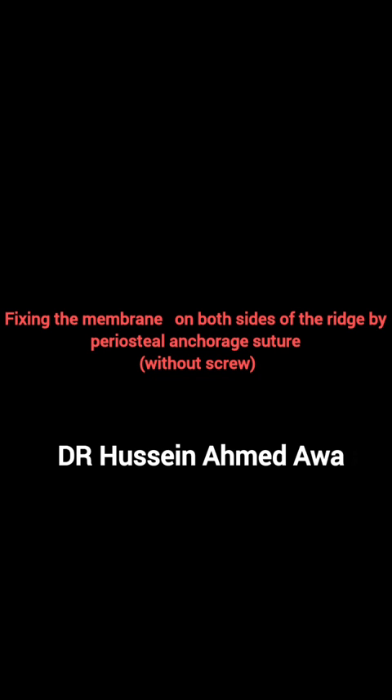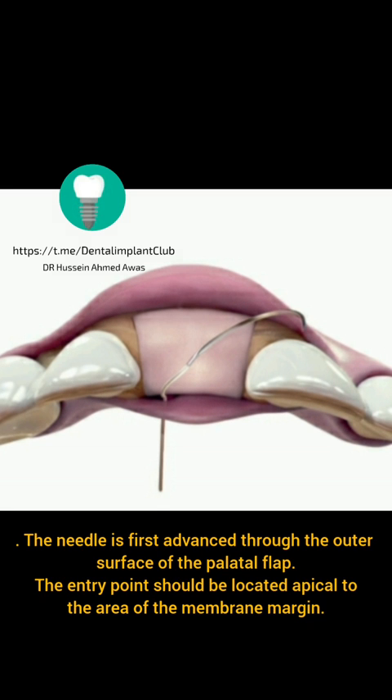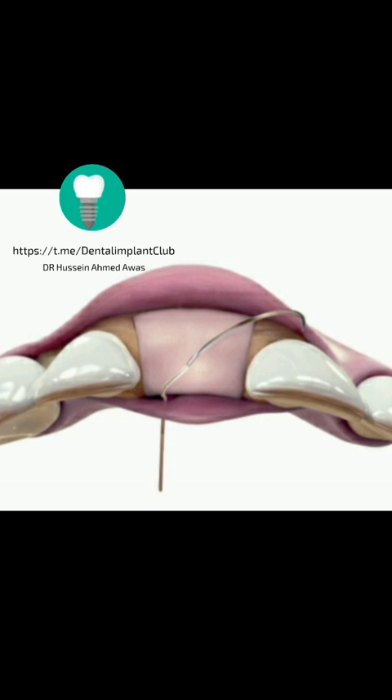Fixing the membrane on both sides of the ridge by periosteal anchorage suture without screw. The needle is first advanced through the outer surface of the palatal flap. The entry point should be located apical to the area of the membrane margin.